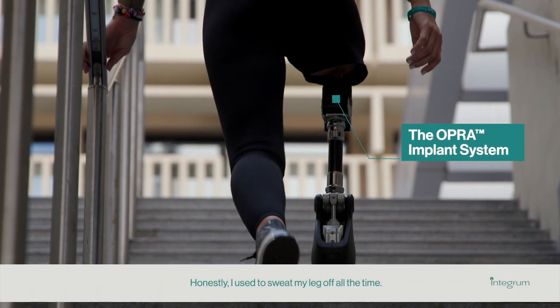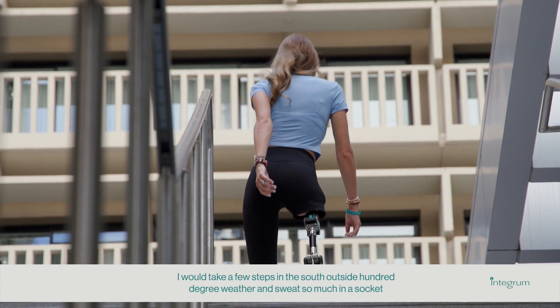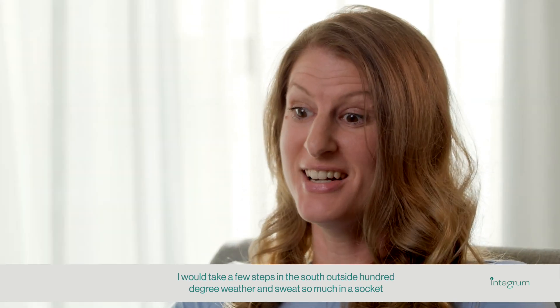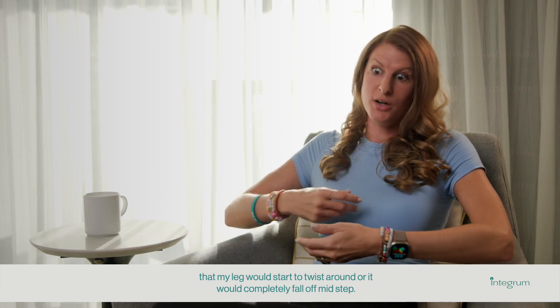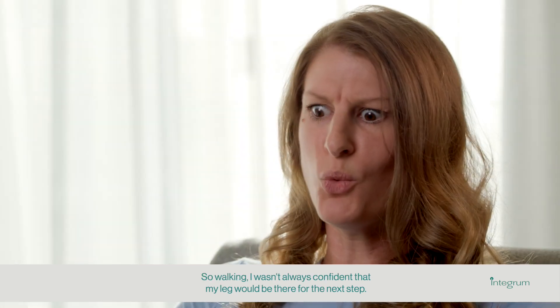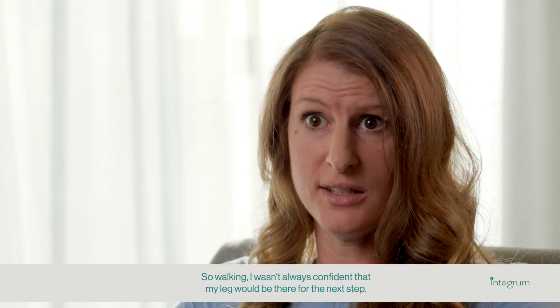Honestly, I used to sweat my leg off all the time. I would take a few steps outside in the south, 100-degree weather, and sweat so much in a socket that my leg would start to twist around or it would completely fall off mid-step. So walking, I wasn't always confident that my leg would be there for the next step.